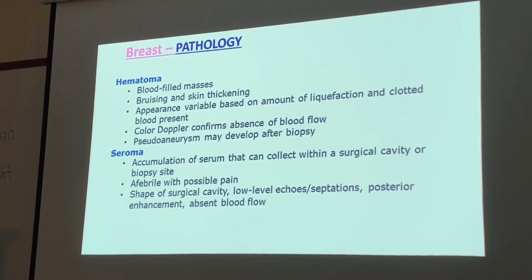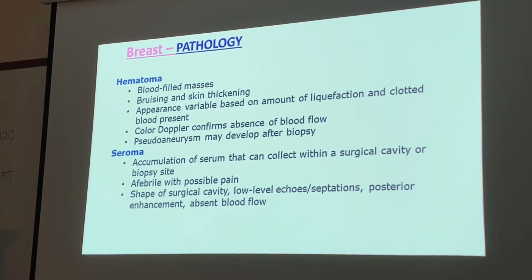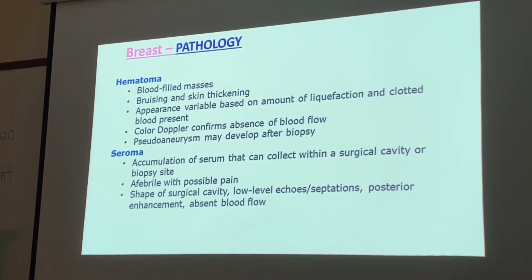Okay. The appearance is going to be different because the longer you have one, the thicker the blood is going to get. Okay. Color Doppler confirms the absence of blood flow, and a pseudoaneurysm may develop after a biopsy. Meaning that after a biopsy, after they try to get a sample from it, you'll see color Doppler near the walls of this hematoma. Okay, what's left of it.